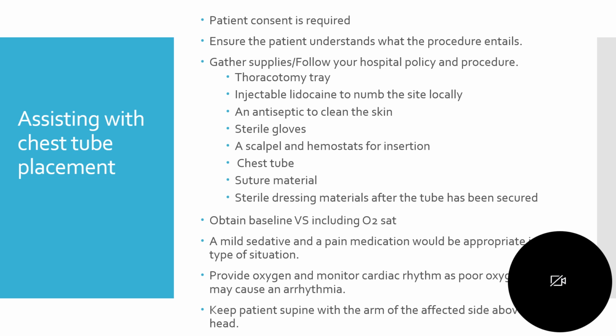Now, before your patient undergoes the procedure, get some baseline information, baseline vital signs, including oxygen saturation. Check your orders and see if there is either a mild sedative or pain medication, because it's a painful procedure. Provide oxygen, and maybe this patient needs to be on a cardiac monitor. So again, we talked about 3-lead and 5-lead. If that's the case, then you need to put them on a telemonitor.